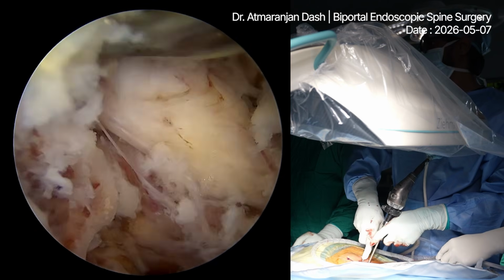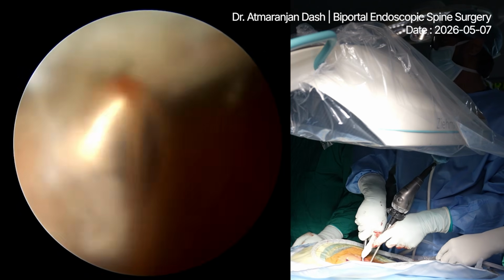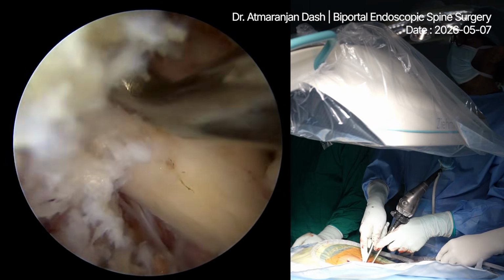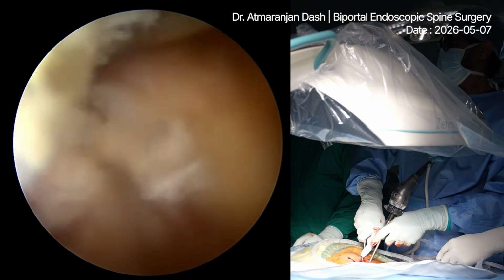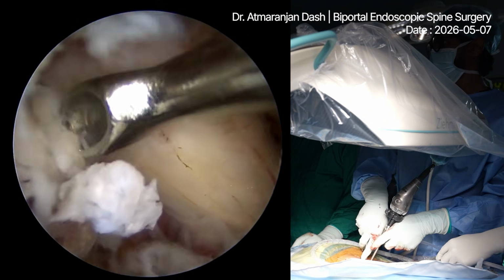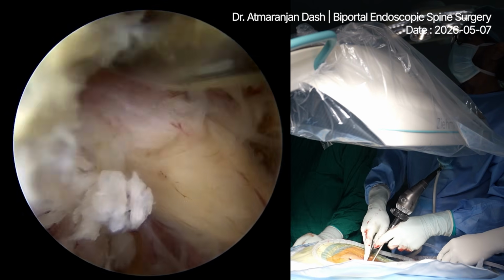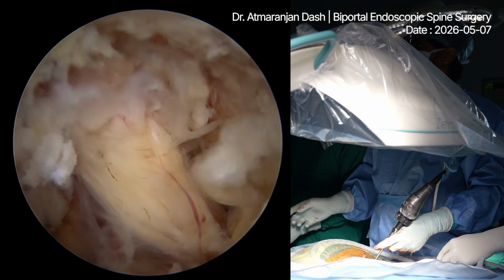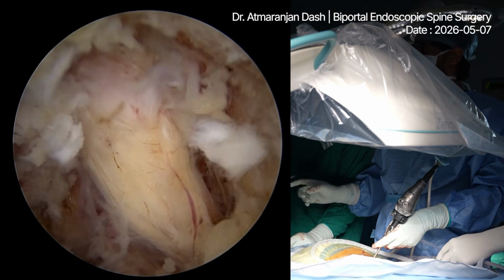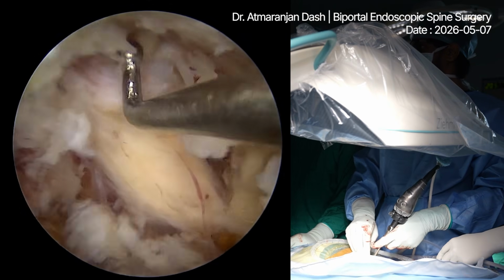A little of the pedicular drilling also sometimes helps. Okay, so I'm widening the foramen. Yes. You see how I'm widening? I'm scooping out all the foraminal bone which is unnecessary at present. Okay. Now it is a small hook. Now see, the hook is going in.